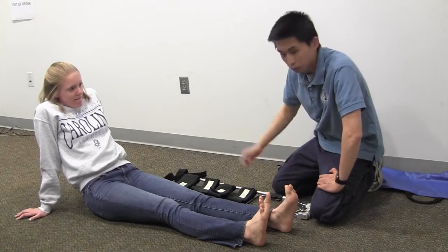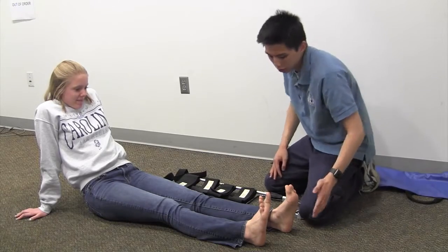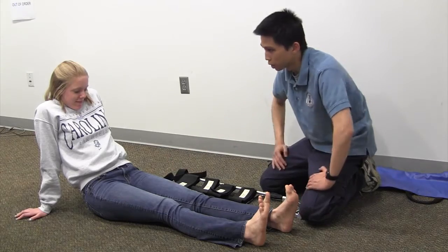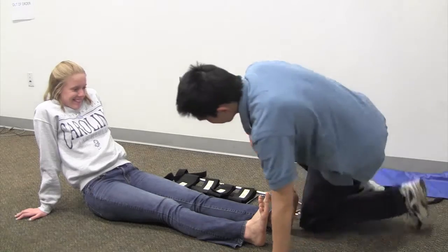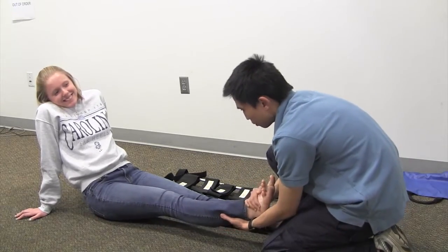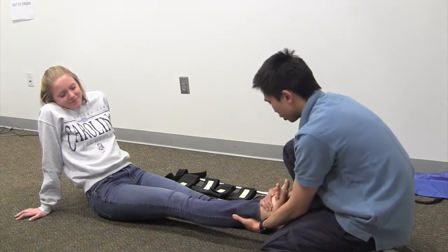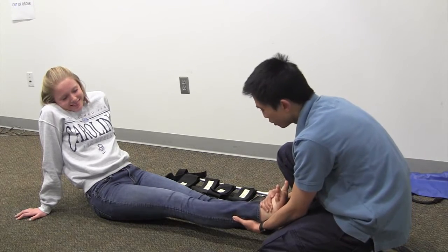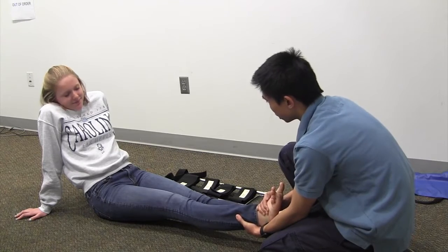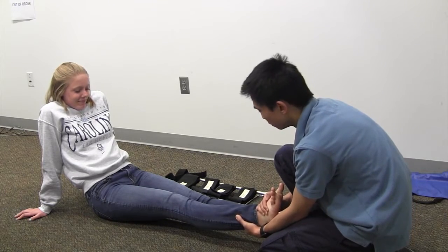We have a patient with a broken femur. You can tell because the injured leg is shorter than the uninjured leg and the patient is in terrible pain. You're going to want to stabilize the leg and pull manual traction to the length of the uninjured leg. You'll be able to tell you succeeded because the patient's pain will have subsided at least a little.